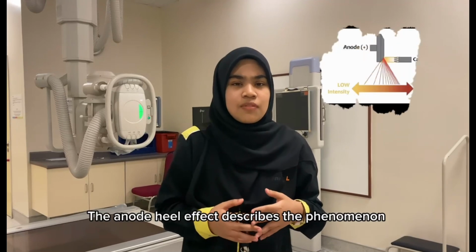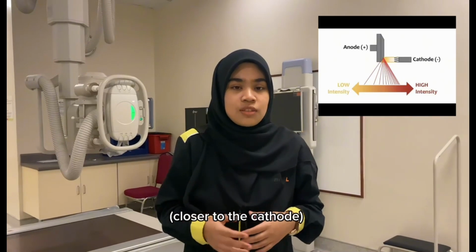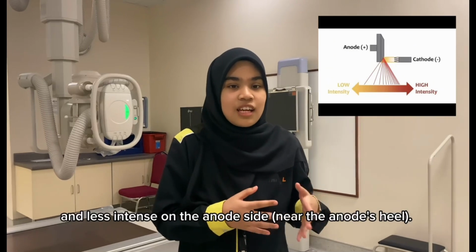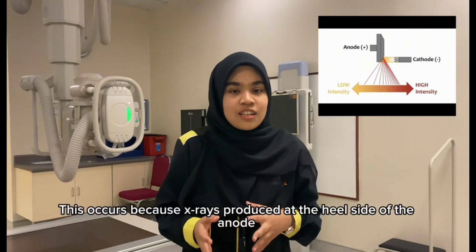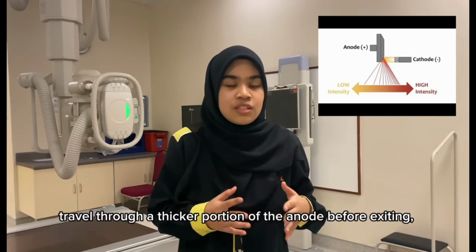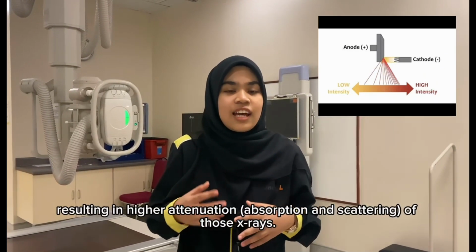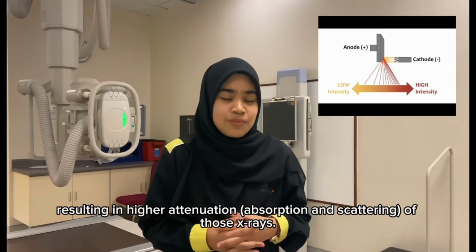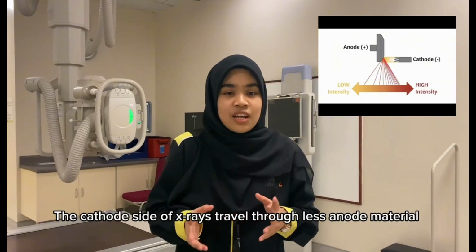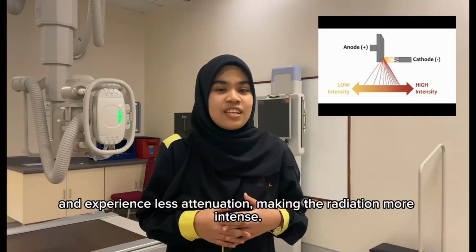Anode heel effect describes the phenomenon where the X-ray beam is more intense on the cathode side of the beam, which is closer to the cathode, and less intense on the anode side, which is near the anode. This occurs because X-rays produced at the heel side of the anode travel through a thicker portion of the anode before exiting, resulting in higher attenuation, which is absorption and scattering of the X-rays. The cathode side X-rays travel through less anode material and experience less attenuation, making the radiation more intense.